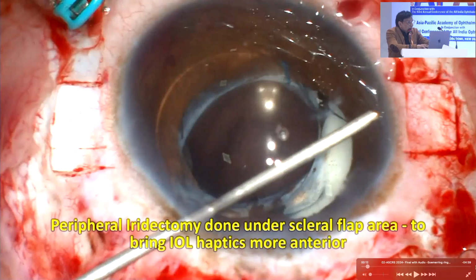Yeah, so this would be a great case to just suture the haptics to the iris as one option, but when you have a Soemmering ring that big, that'll get in the way. So you do have to try to strip it off, and Sun Pek Chi has a beautiful technique where she uses an empty IOL cartridge, and if you pressurize the globe with viscoelastic, everything wants to exit through that exit pipe, and that might be useful in this type of case.